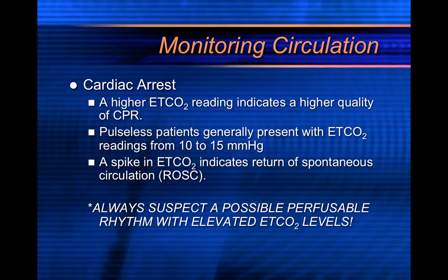And the ultimate circulatory compromise is the cardiac arrest patient. So if you've got somebody in cardiac arrest and you're monitoring capnography, you could suspect low values. But as you're working that patient and doing CPR, as the values increase, that is a good indicator of good CPR. And think about what that means. As you get a higher end-tidal CO2 value, it's an indication of higher quality CPR. And what is the most important thing we do for a cardiac arrest victim? It's CPR. So wouldn't you want to get these values on your patients to know that you're giving better CPR? To me, it seems like a dead set, easy answer.